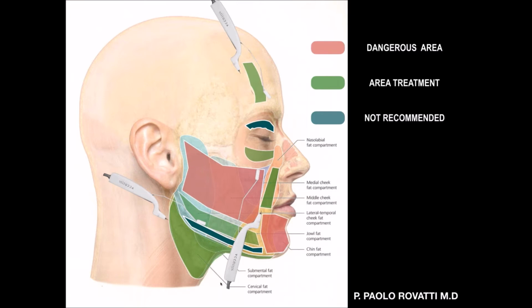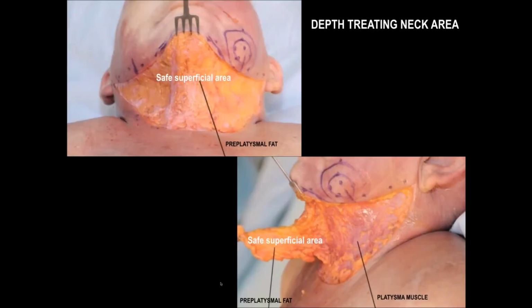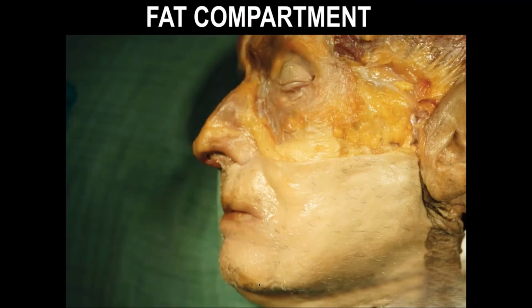A few anatomical points. These are the safe compartments for lower third treatment in green. So this is another depth treating neck area. This is a superficial safe area. This is pre-platysmal fat. We don't need to go below, because we find platysma that you can see here on the right, below. Platysmal muscles is just below the pre-platysmal fat, and we need to stay on the fat.